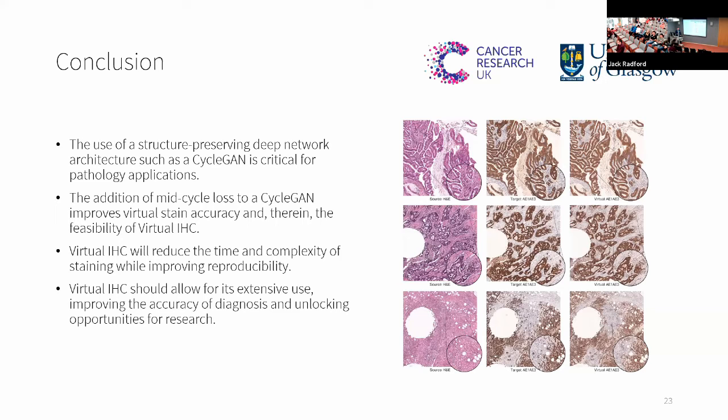And we hope that these virtual IHC techniques can reduce the time and complexity of providing IHC to every patient and improve the accuracy of diagnosis. And we hope that through this we can also unlock more opportunities for research as well.